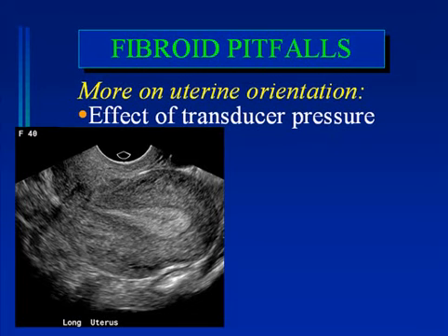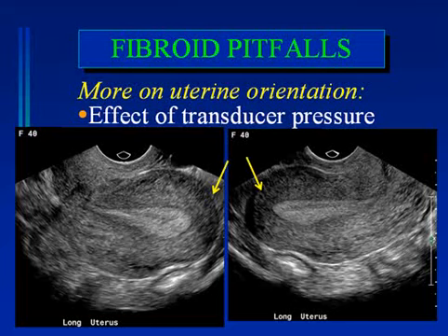And it's not just degrees of bladder distension that can do this. On an endovaginal ultrasound, the uterus can look both retroflexed, as it does here, and anteflexed, as it does here, during the course of a single examination, and this is thought to be due to transducer pressure. In this particular patient, the uterus was flopping into both positions multiple different times, depending on how the transducer was oriented and presumably on how the pressure was affecting its orientation. But this is relatively uncommon. In most cases, the uterus will stay one way, either retropositioned or antepositioned, throughout the study.